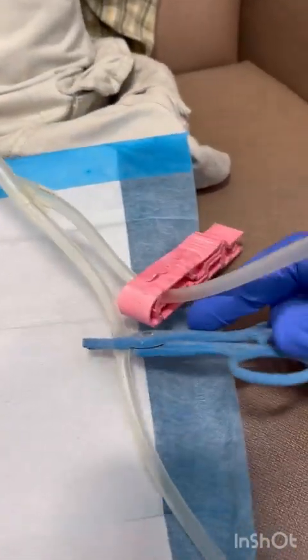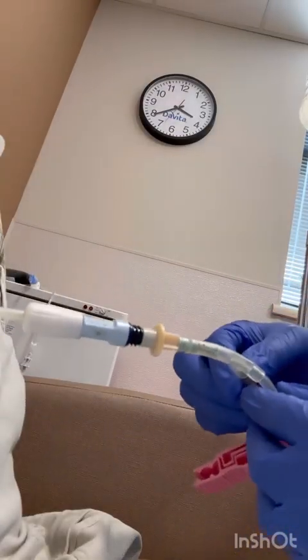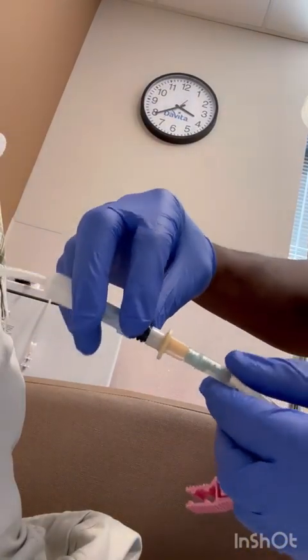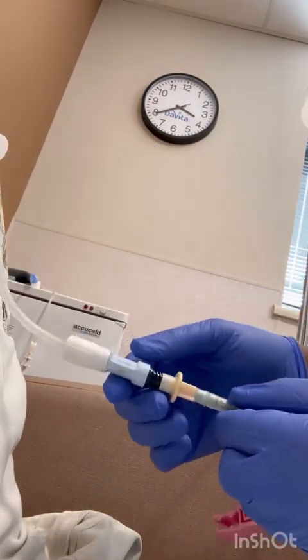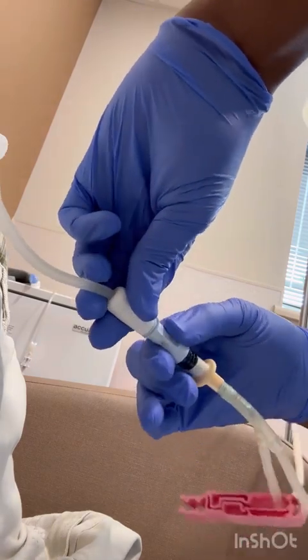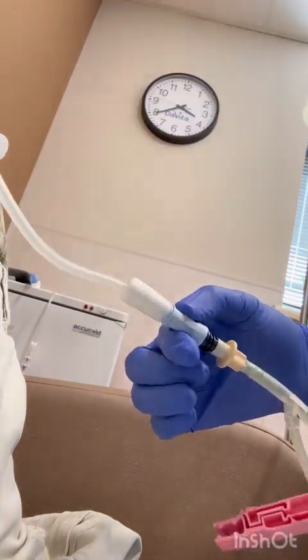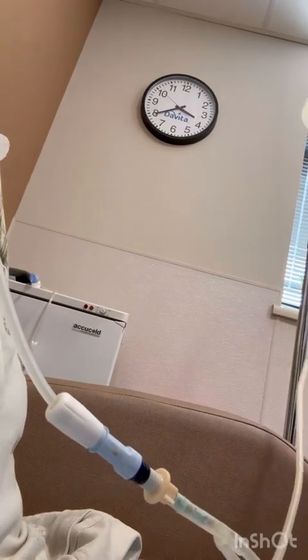Now Steve's connected. First thing we always do is drain. Take off that blue clamp that leads to the drain bag. Break that frangible — that thick plastic piece right there — back and forth around the world. Then open that transfer set to drain Steve. Steve is empty, so we don't expect anything in that drain bag, and there's a whole lot of nothing in that drain bag.